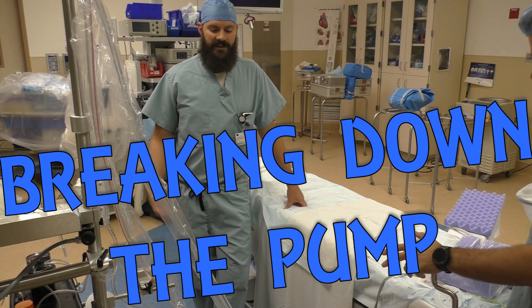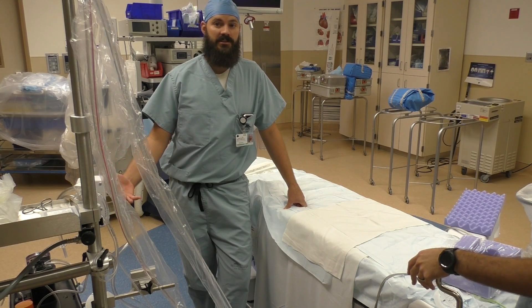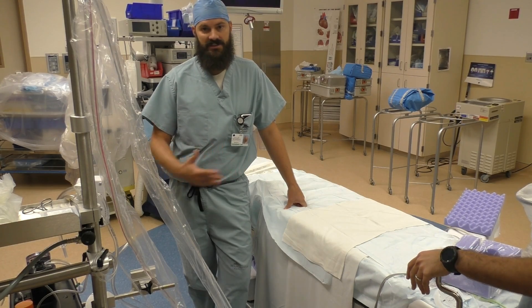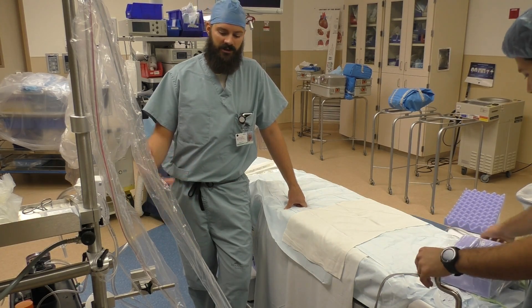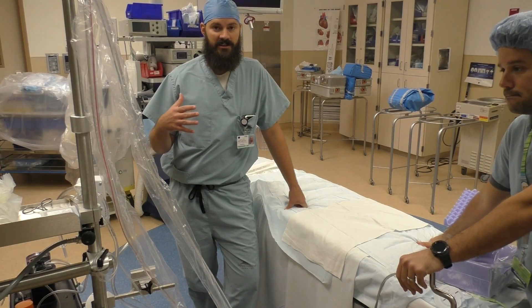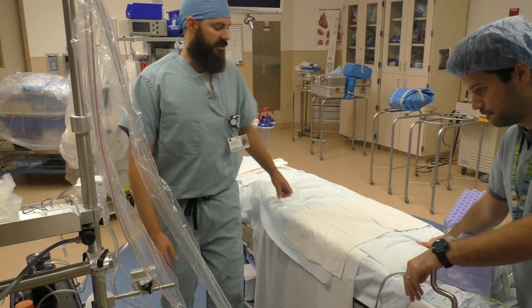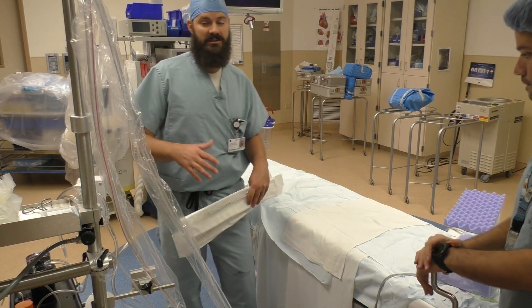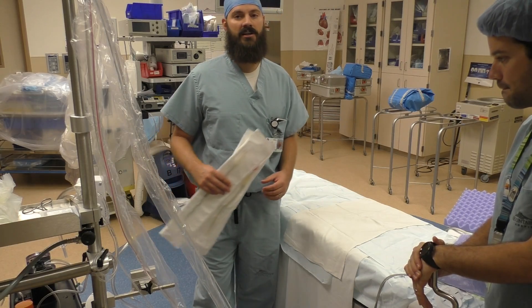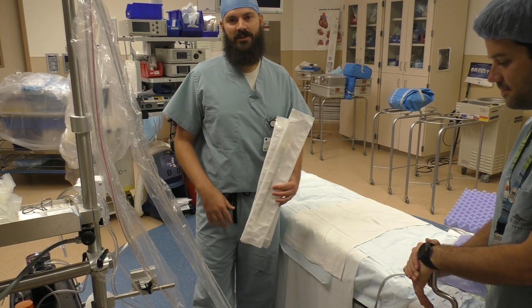The heart-lung machine is basically useless if we can't hook it up to the patient — if we're not able to receive the blood and get it back to the patient, there's no reason to even have it. So let's talk about how we actually get the patient onto the heart-lung machine. It's going to be a very busy time for the techs; they're going to be pulled in lots of different directions.